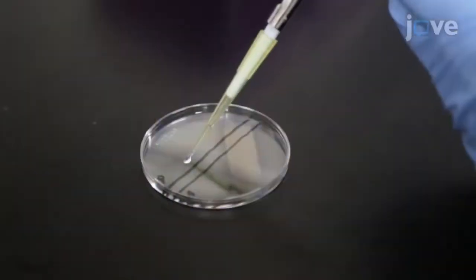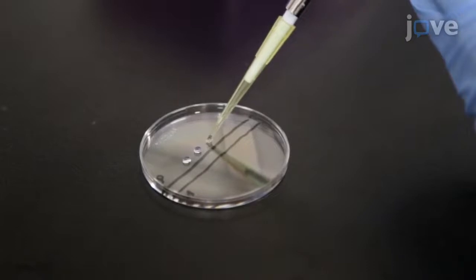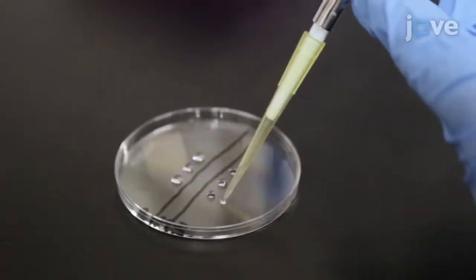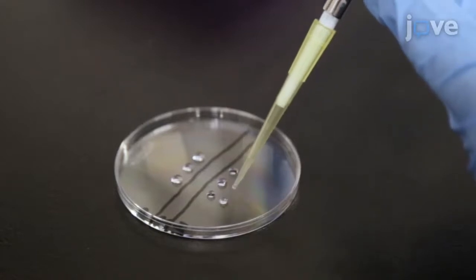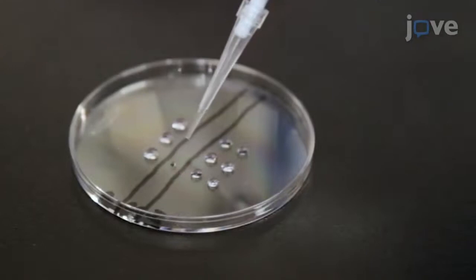In a 60-millimeter dish, place 2 to 3 drops each of PVP-HTF, 5 to 6 drops of HEPES-buffered CZB, and EGFP-H2B mRNA.